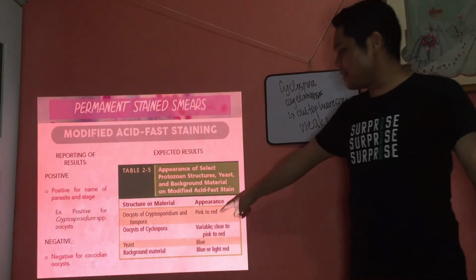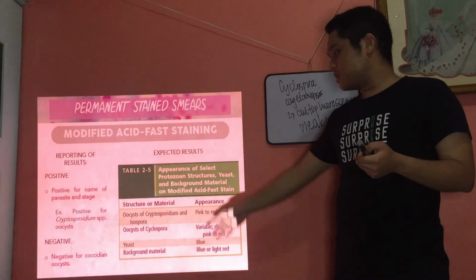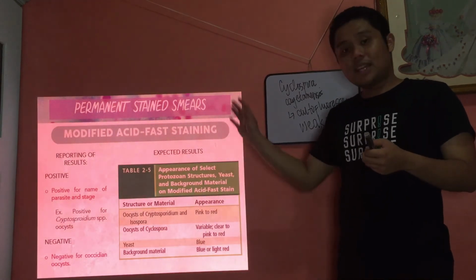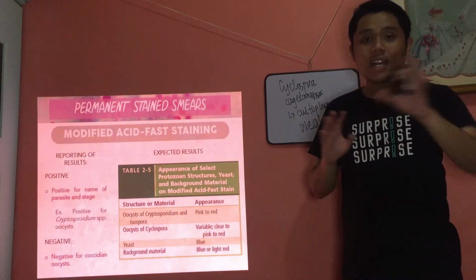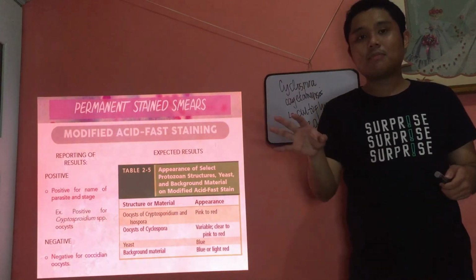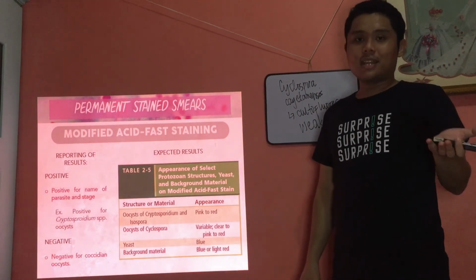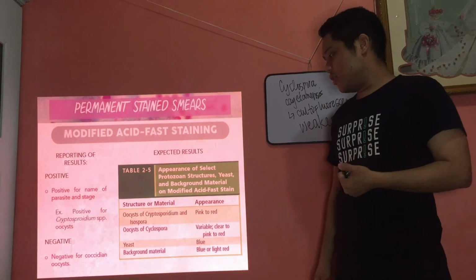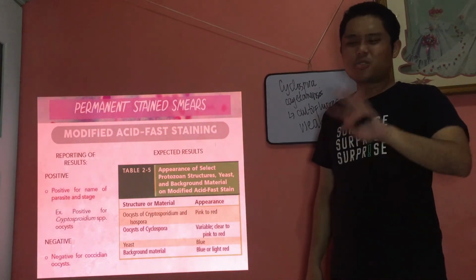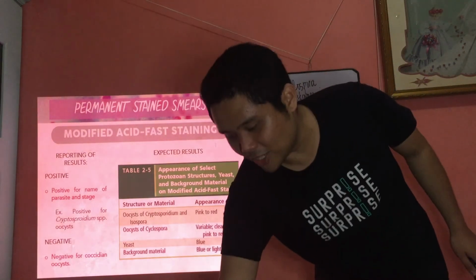Alright, so ang color again, pink to red. So it can be pink because again, lesser. Pwede pong red. Alright, for Cyclospora variable, clear to pink to red. The yeast and background material, as I mentioned, non-acid fast organisms, they will take up the secondary stain. Could be methylene blue, or again, green. Okay, background material, blue or light red. Basta, dili totally red. Okay, basta usually blue lang na siya. Alright, or green. Okay, now here are some of your pictures.